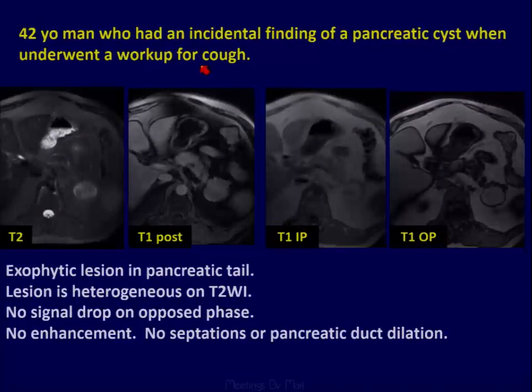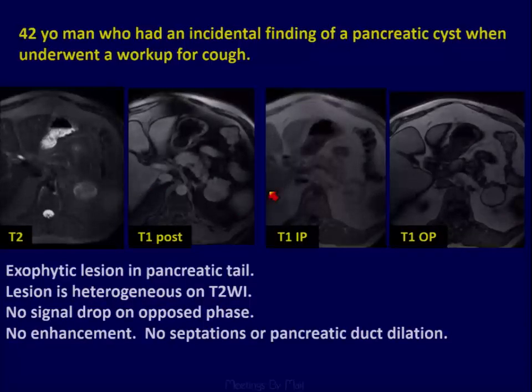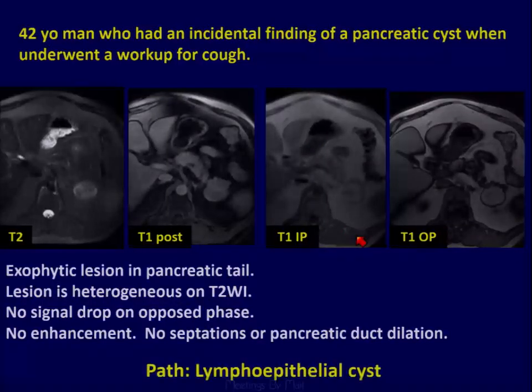Here's another example — an incidental finding of a pancreatic cyst in a patient who underwent workup for cough. This is an exophytic lesion in the tail of the pancreas, slightly bright on T2, no suppression on out of phase, no internal enhancement, no septations, no dilated pancreatic duct. Unfortunately, this was a lymphoepithelial cyst.